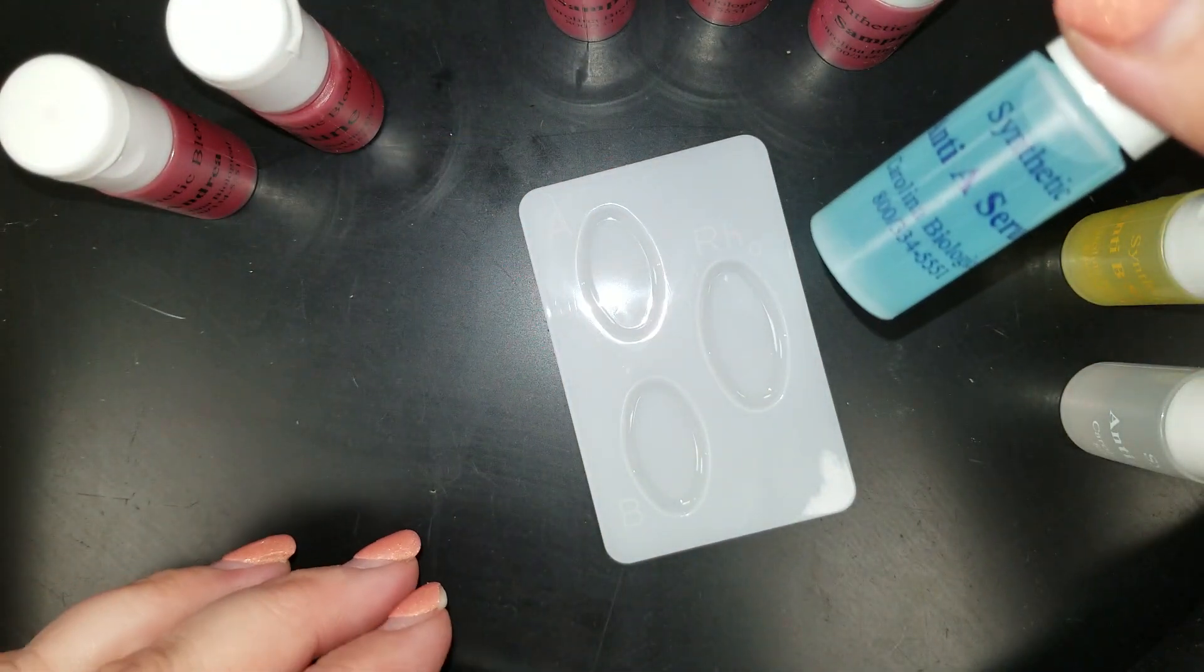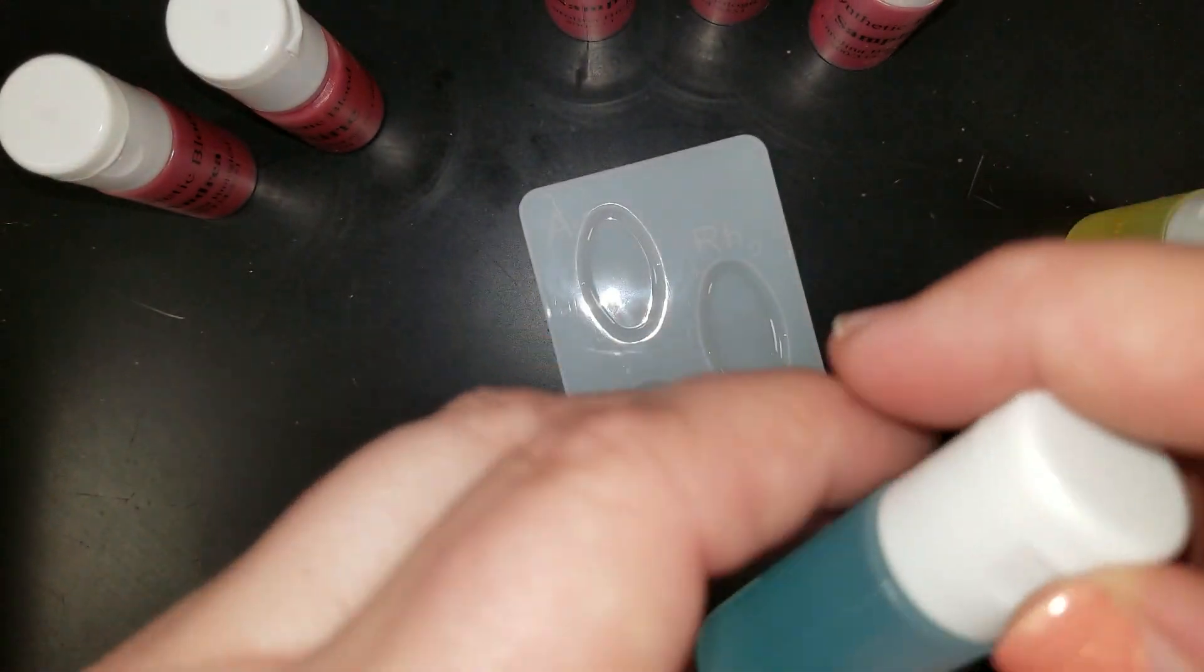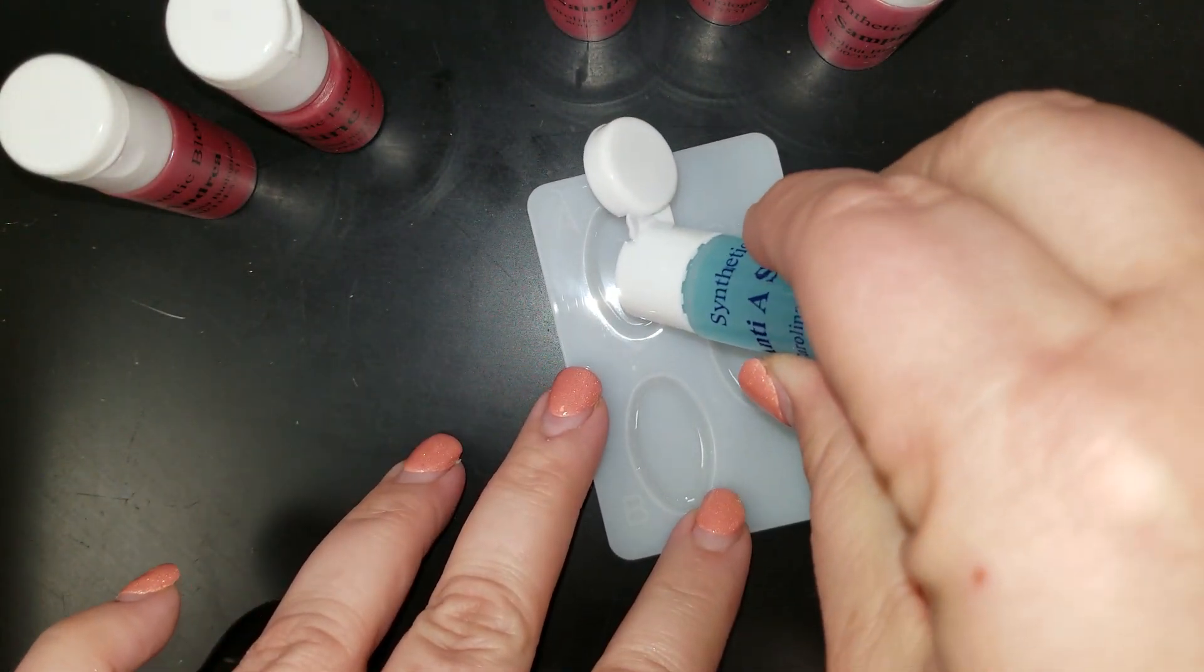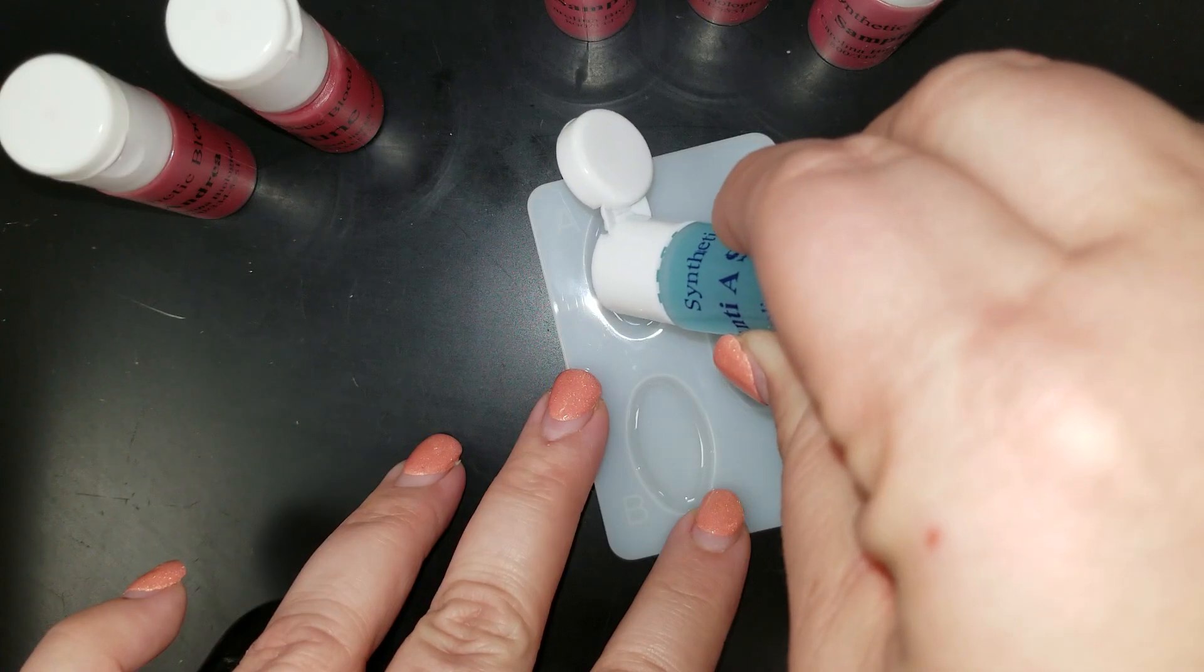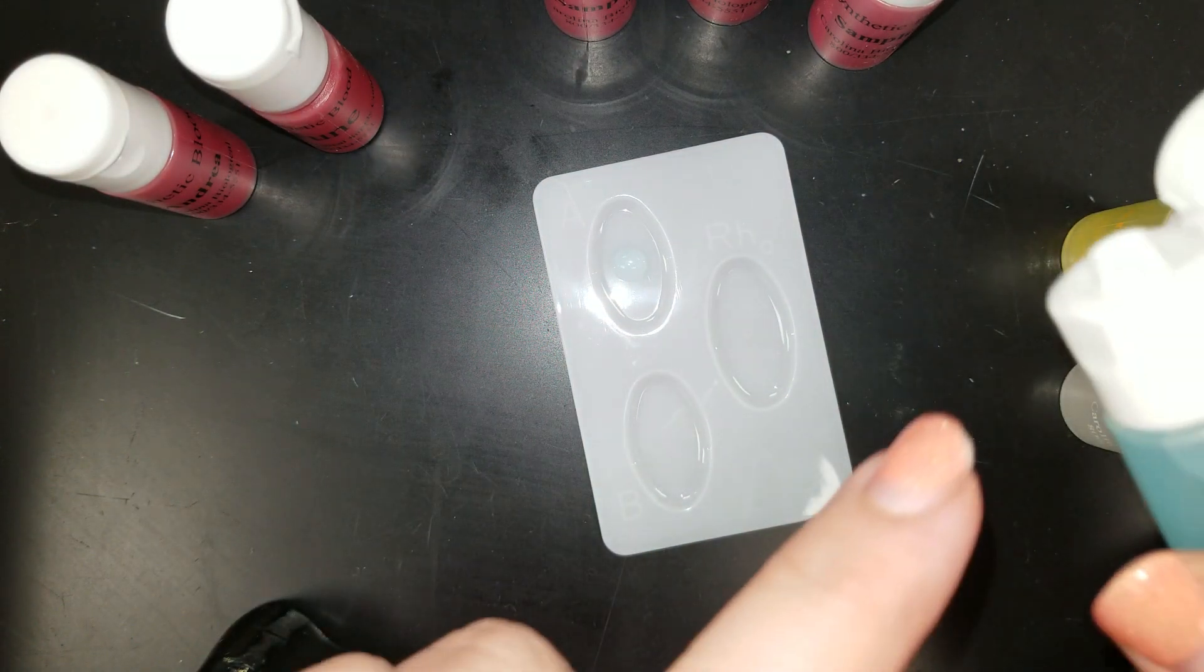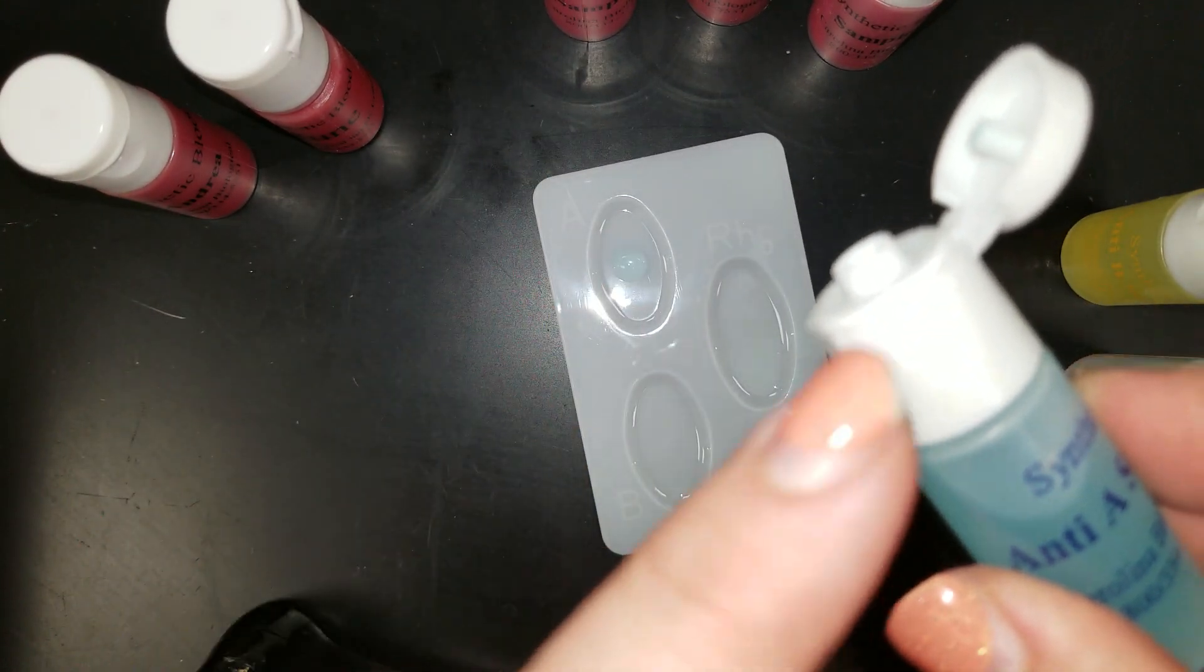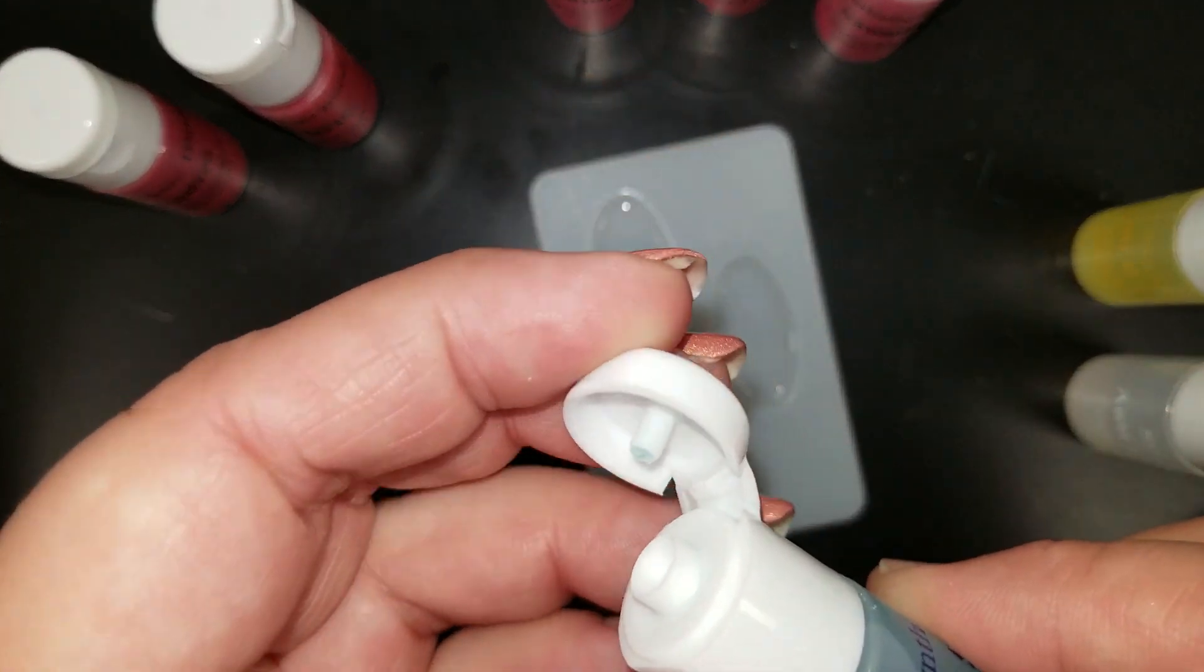So your serum is also labeled, your anti-A sera is blue, and you're just going to place one drop into the serum A well. Be sure not to touch these tips to any of your other surfaces. Nothing should touch this tip that would cause contamination.